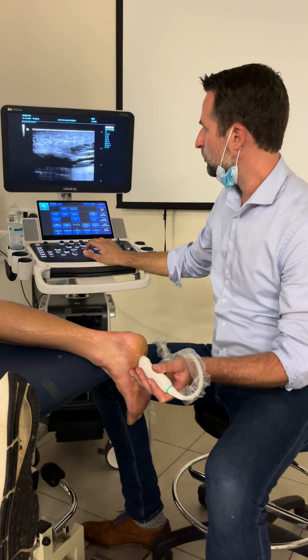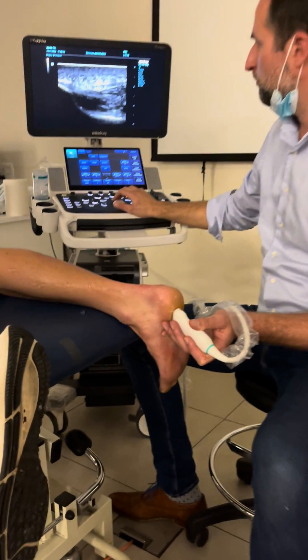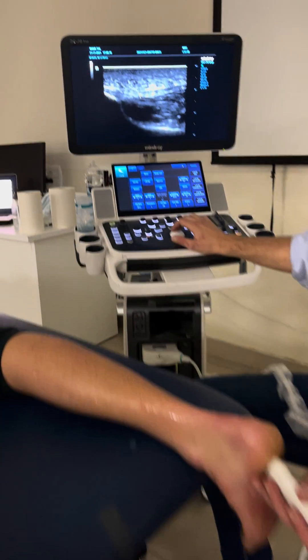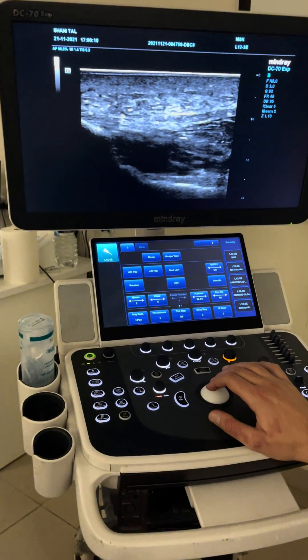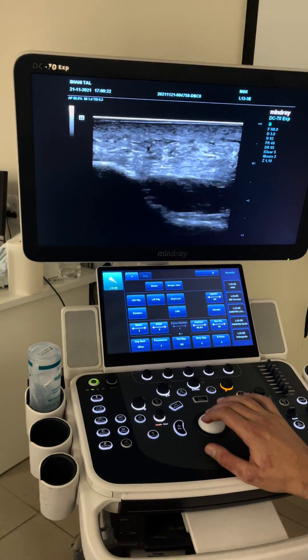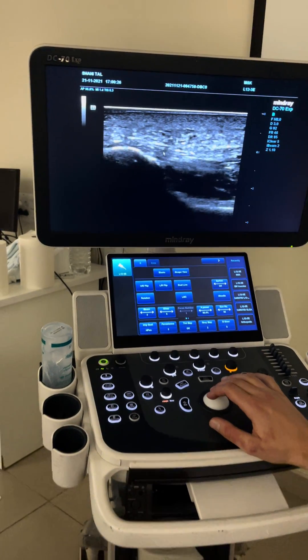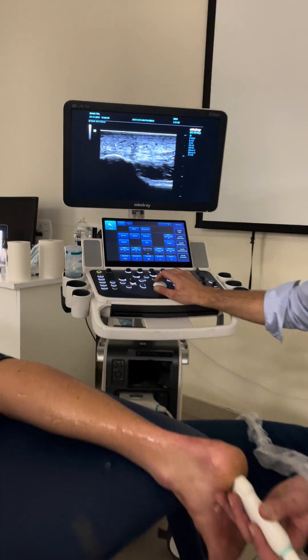We go a little bit back to our origin. This mid portion is where you can see a mid-portion fasciopathy, sometimes caused by blunt trauma or overuse. But the most typical one you see in your clinic is a fasciopathy at the insertion, usually because of overuse.